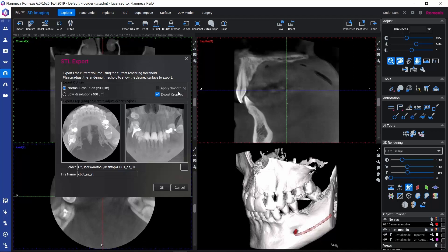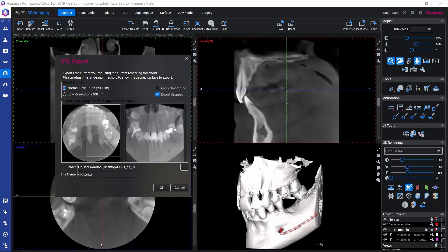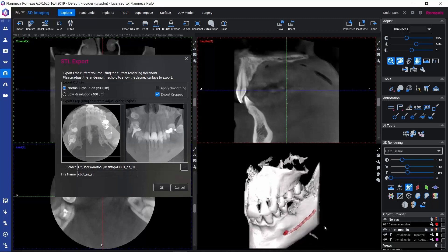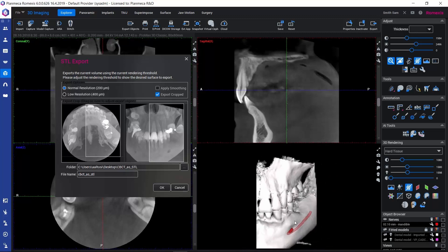If we keep the Export Cropped option selected, we can export just part of the volume as a surface model — for example, just some half of the volume. We can determine the cropping by drawing a rectangle on either of these views. If we drag a rectangle here, we can also see in the 3D rendered view that now we would be exporting just part of the volume.